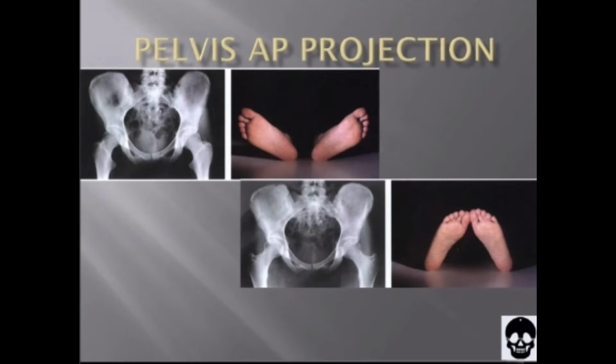The bony landmarks used in radiography of the pelvis and hips are as follows: iliac crest, anterior superior iliac spine, pubic symphysis, greater trochanter of the femur, ischial tuberosity, and tip of the coccyx. Most of these points are easily palpable, even in hypersthenic patients.